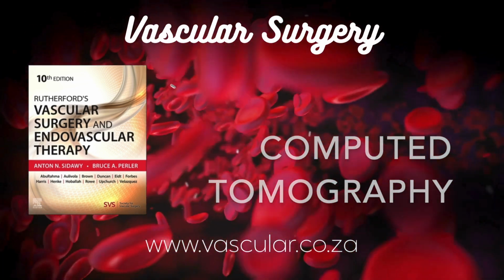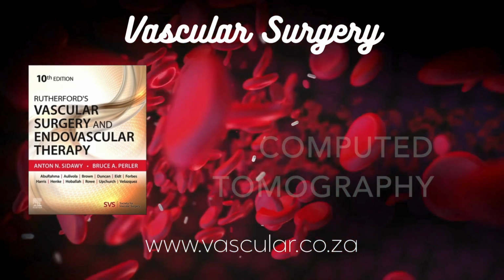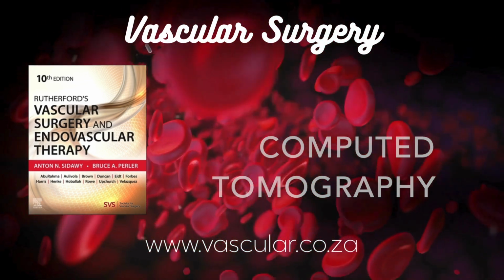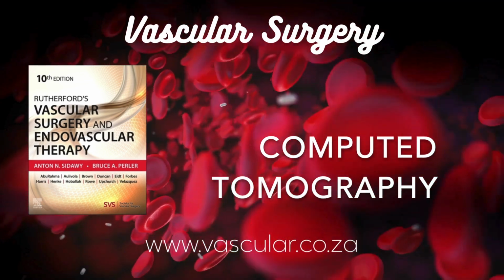Needs good contrast timing though, right? Absolutely critical to catch the contrast wave as it moves down the legs. But the high resolution is great for defining exactly where narrowing stenoses are, how severe they are, and planning interventions. It's also proven very accurate for assessing the small runoff vessels below the knee. Any challenges with PAOD?